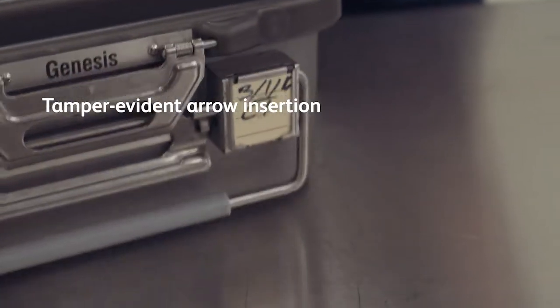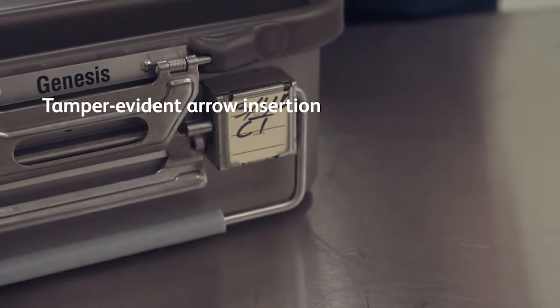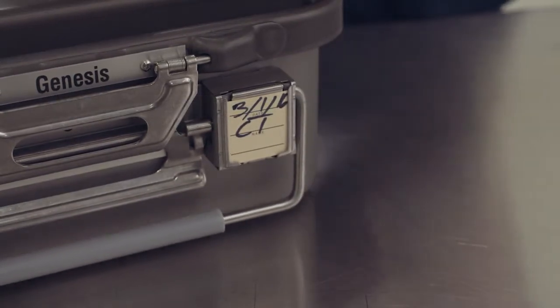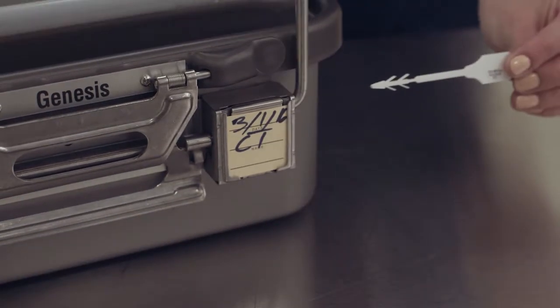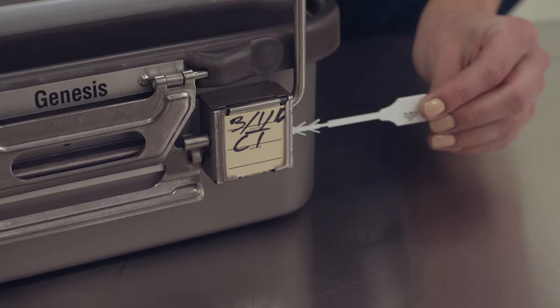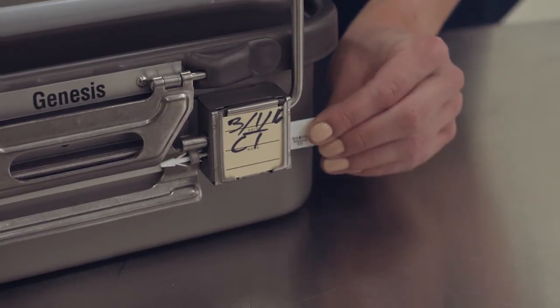To insert a tamper-evident arrow, move the carrying handle to an upright position. Orient the arrow so that the chemical indicator dot is facing outward. Insert one arrow into the open channel found under the data block. Advance the arrow until both sets of tabs have completely passed through and are visible.